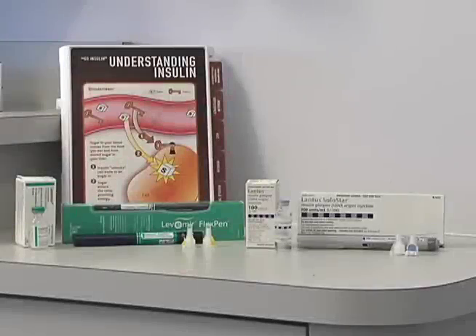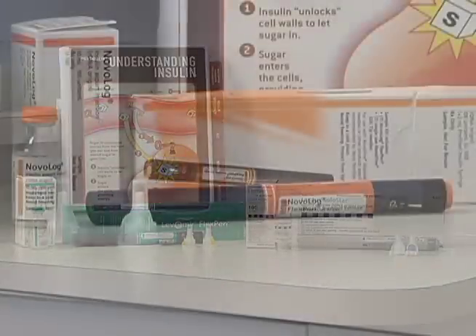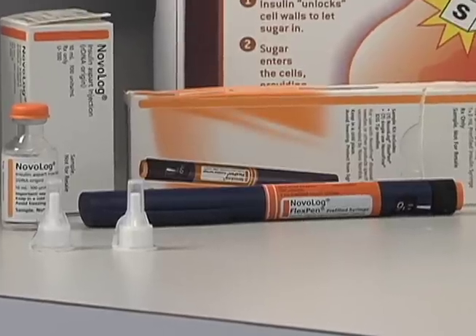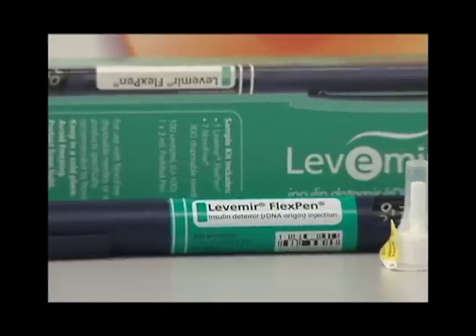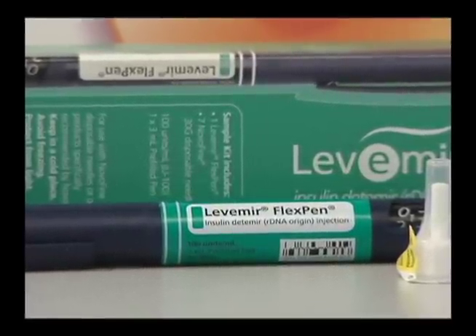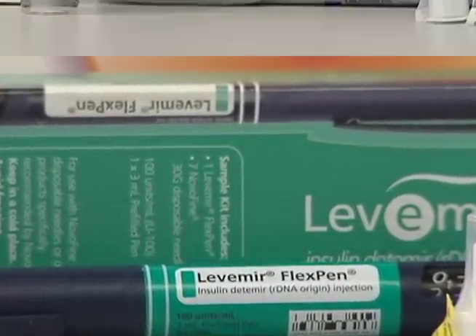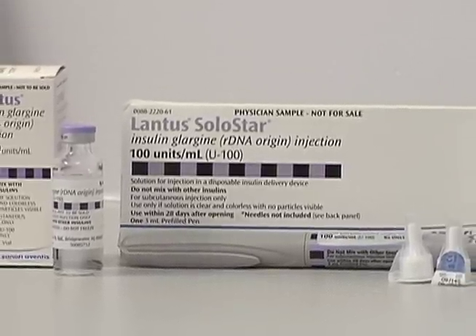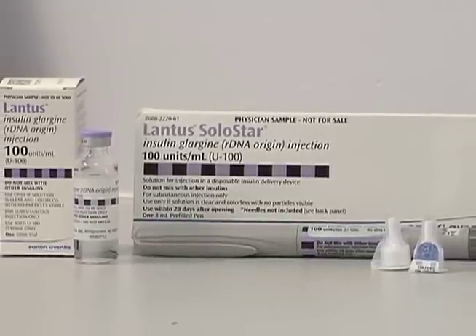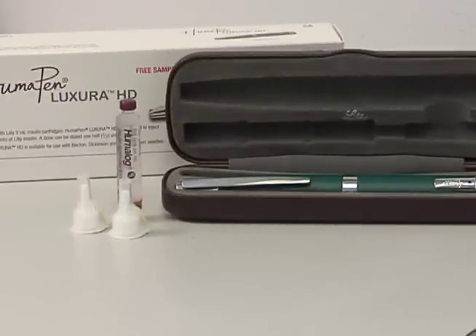Some patients prefer to use insulin pens because they find them more convenient. Since the pens begin dosing at one unit, patients needing doses as small as a half unit should continue using syringes. While pens are more expensive, they are covered by most insurance and a prescription generally covers a box of 5 pens. Most pens are pre-filled with insulin and disposable, while some pens are refilled with insulin cartridges and are reusable. Some will deliver doses in half unit increments beginning at one unit.